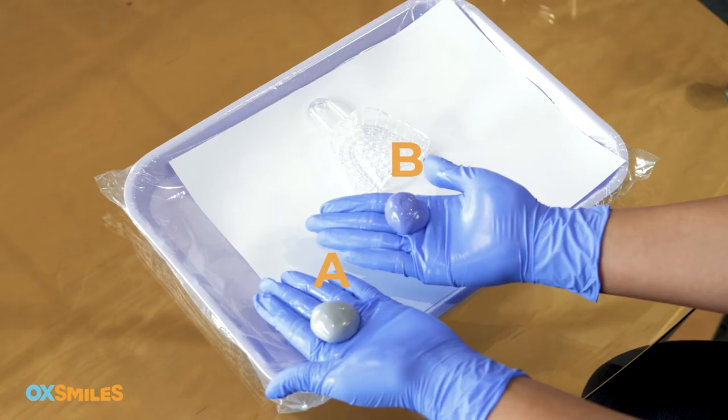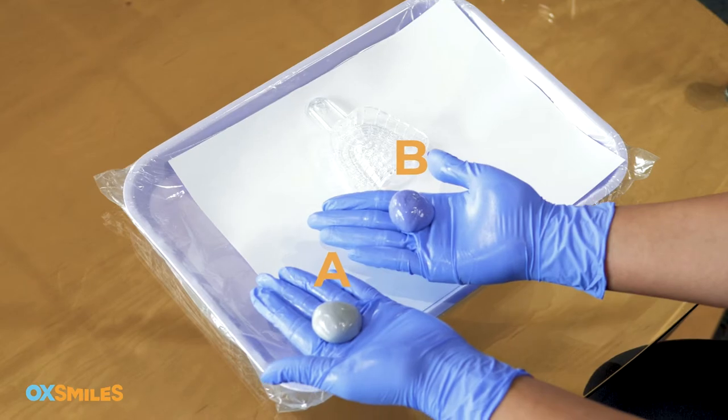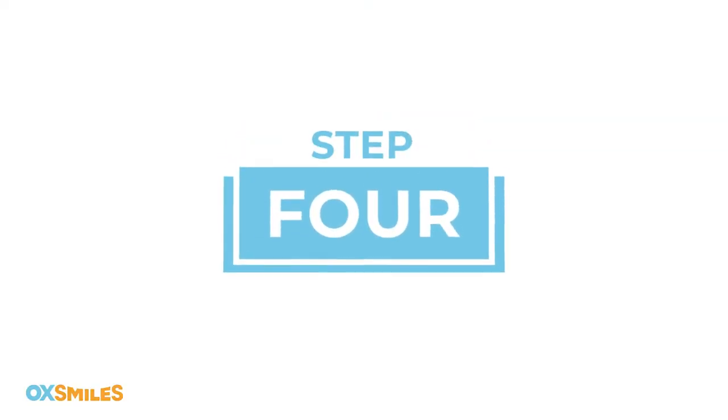Step three: get your first impression tray. Open one jar of putty A and one jar of putty B. Be sure they are at room temperature, have your mirror in front of you, and set your timer to five and a half minutes. This is the total time needed to complete the imprint of your teeth.